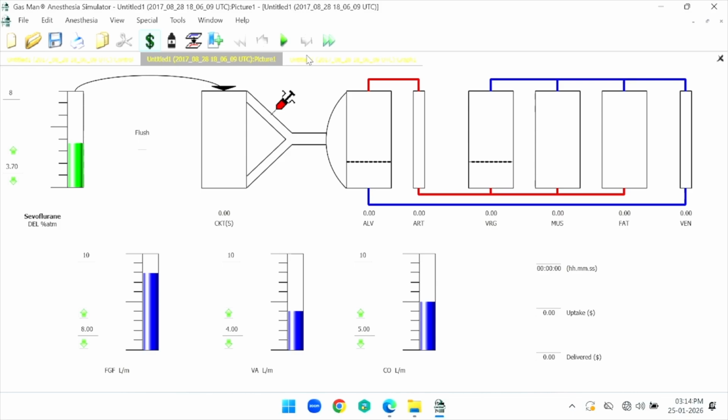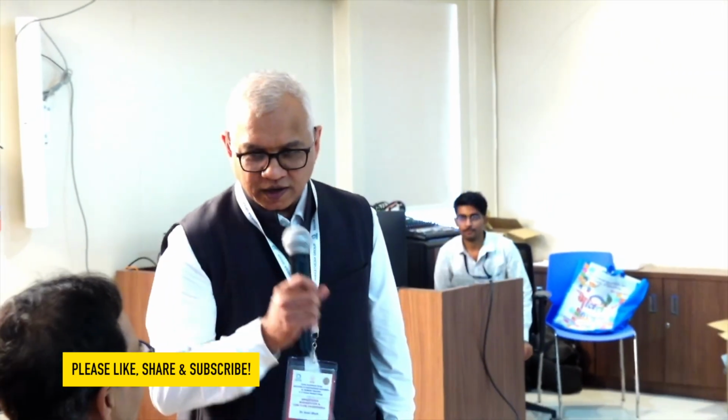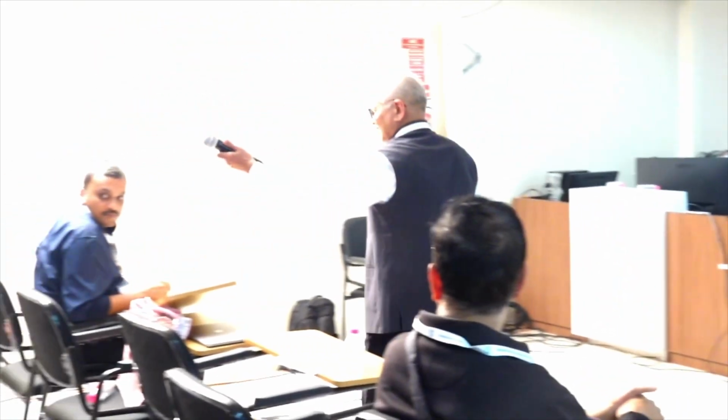A fair idea. Okay. So anyone, how do you start your anesthesia? Inhalation anesthesia, fine. Anyone, how much flow do you start with if you are using Sevoflurane? It's not a criticism. We should know what we are doing.